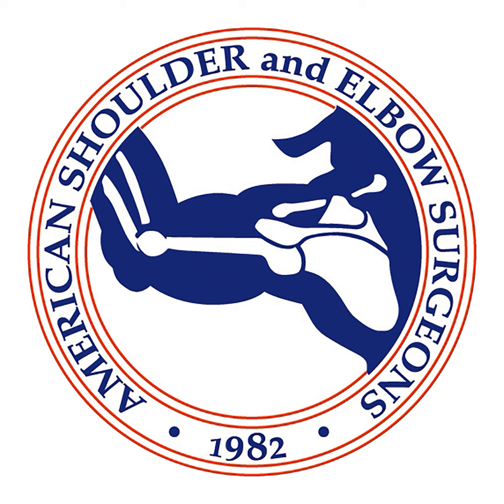The way I do it is I use an extramedullary cutting guide, bar down the forearm, 30 degrees of retroversion, 135 inclination. I actually pin the extramedullary guide with 2 pins to the humeral shaft, and I make the initial cut. Then I make a secondary cut to adapt that to the patient's individual anatomy. But I never do a freehand cut, because I think you can get lost.